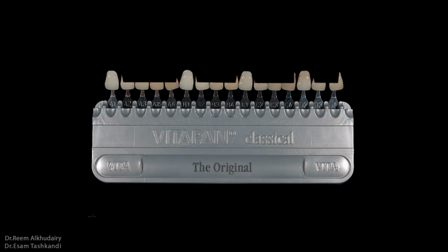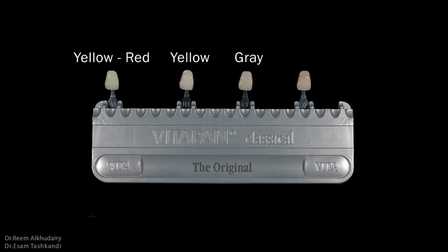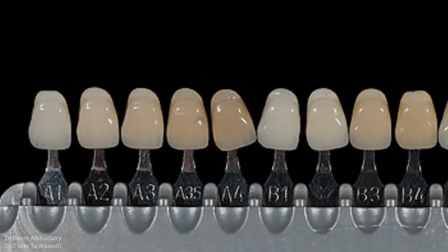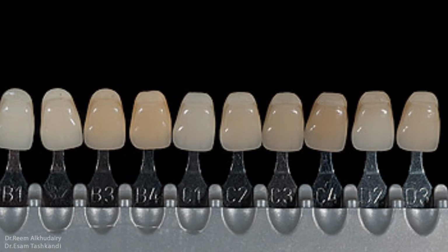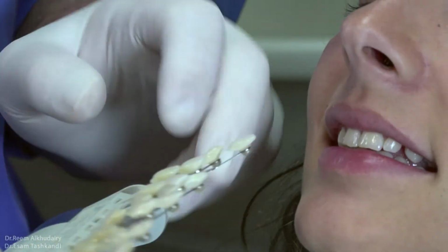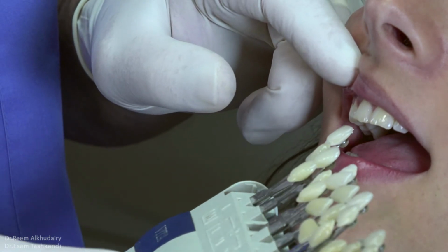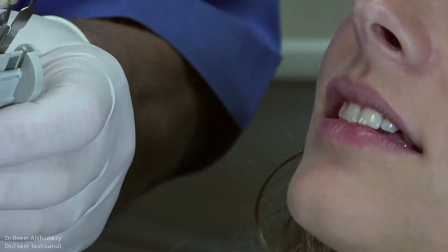The Vitapan Classical Shade Guide has 4 hue categories: A, yellow-red; B, yellow; C, gray; D, red-yellow-gray. The shade matching procedure is simply done by choosing the nearest hue and then selecting the appropriate chroma. Criticism of the empirical design of these shade guides and the color distribution led to the development of the 3D Master. The 3D Master Shade Guide is based on scientific findings and the systematic coverage of the tooth color space of natural teeth according to the colorimetric CIE Lab order principle.